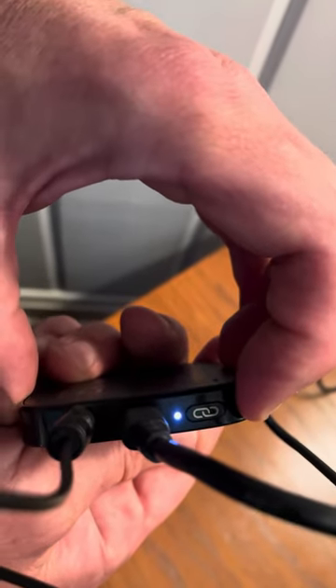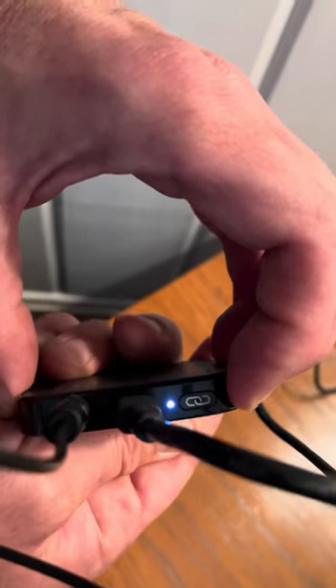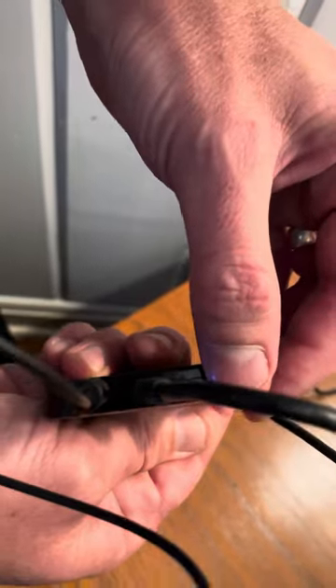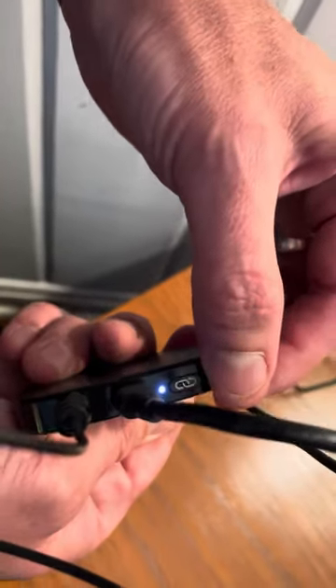After holding the button it goes through a series of flashes and then it should glow orange. It looks like it didn't complete successfully in this instance.